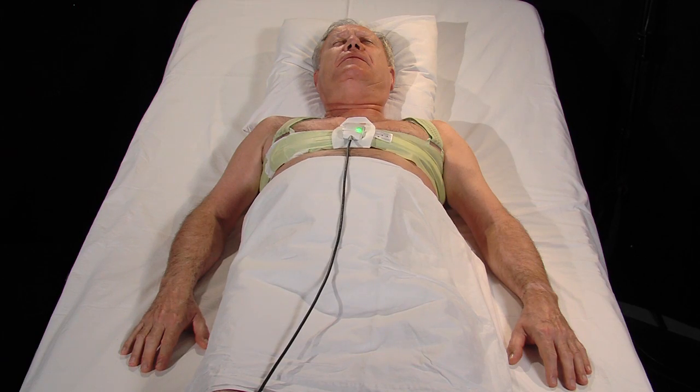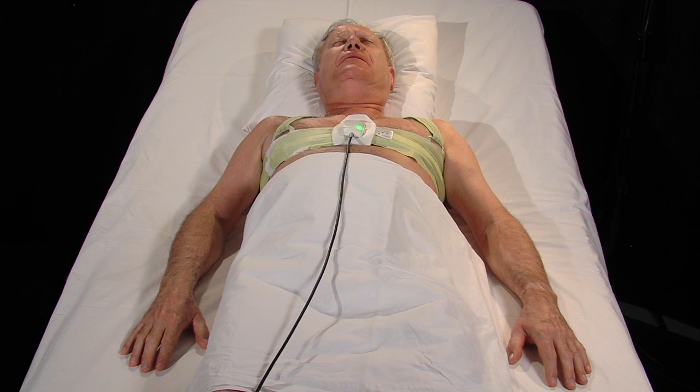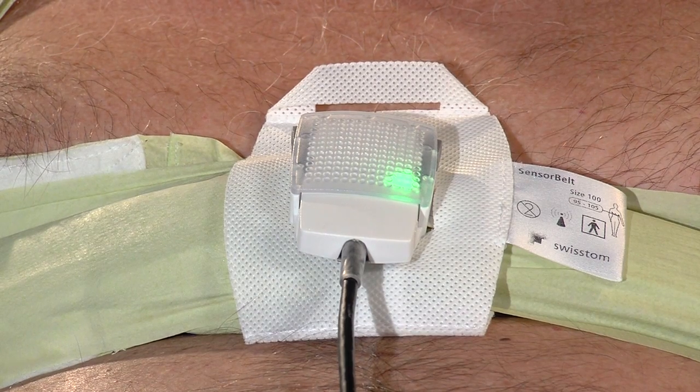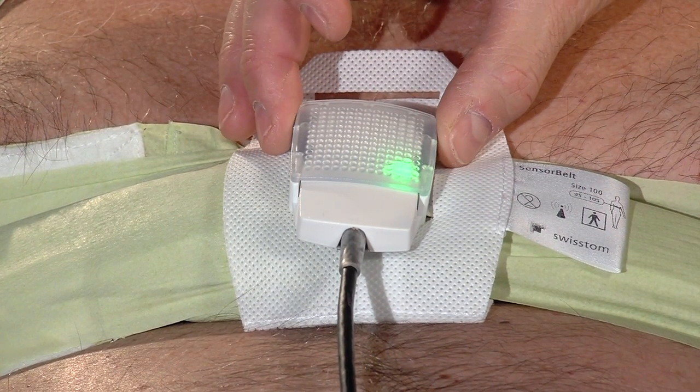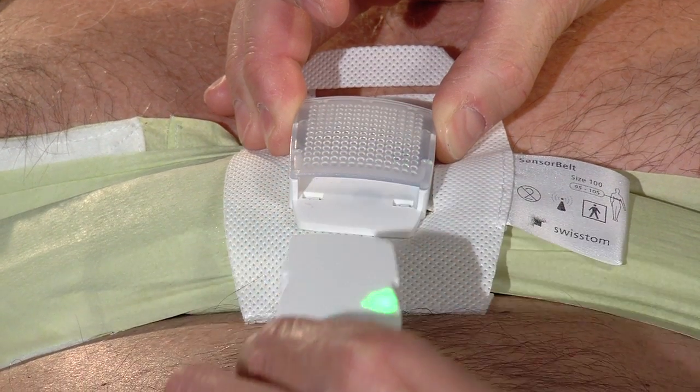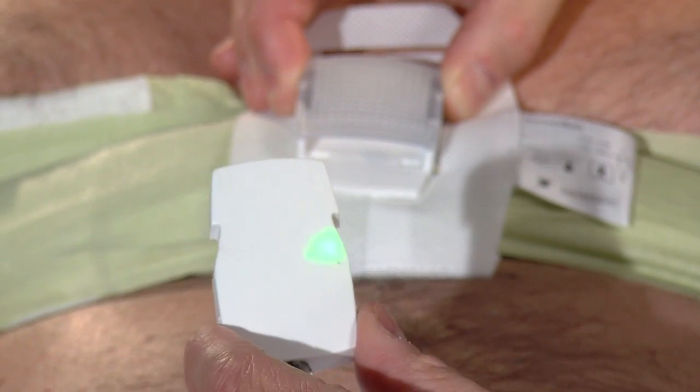To stop the measurement, do not pull on the cable to unplug the connector. Instead, depress the grey release clips on either side of the docking station with one hand. This will eject the plug with a click. The green light will switch off.